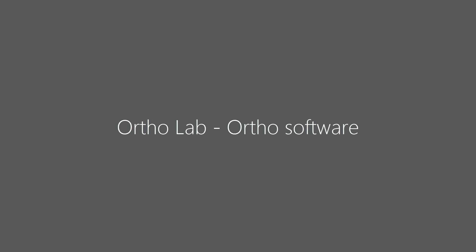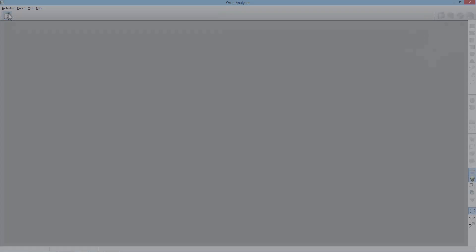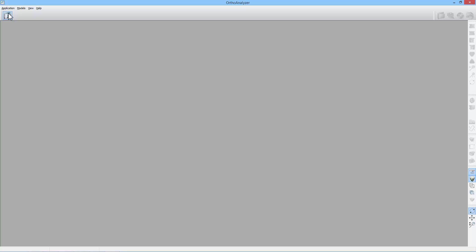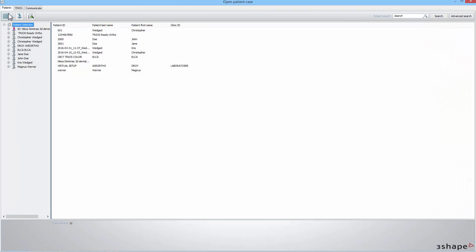Now you will learn the Ortho Lab part of the integration workflow. In Ortho Analyzer, enter the Patients Management window. To access the orders sent via Direct Connection, click the TRIOS tab.